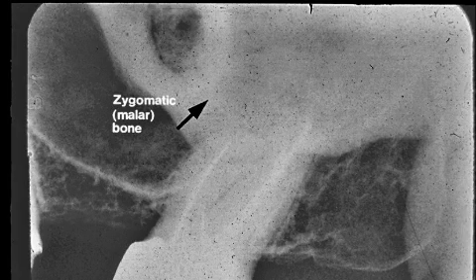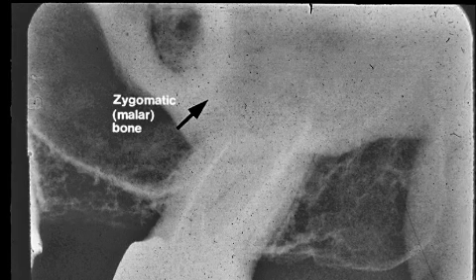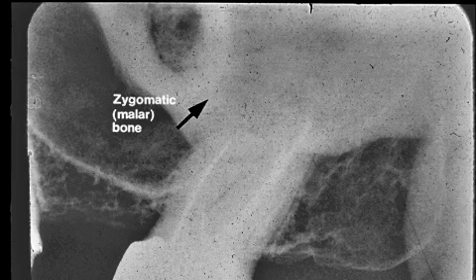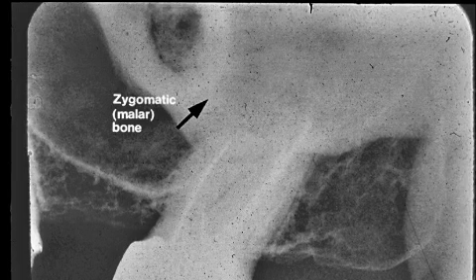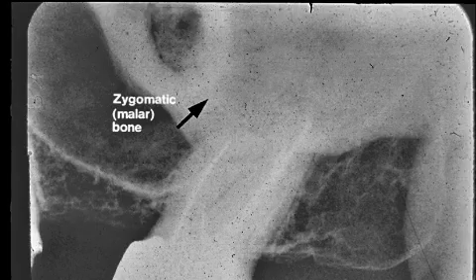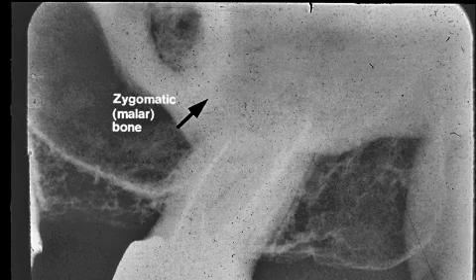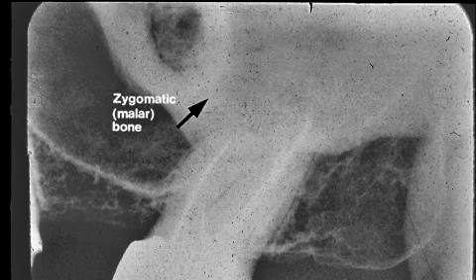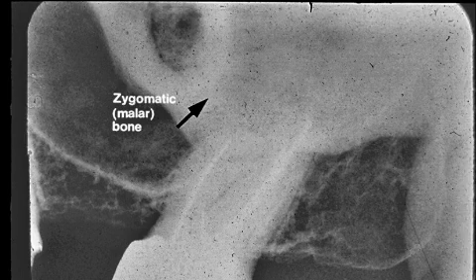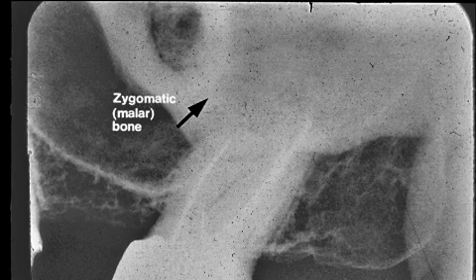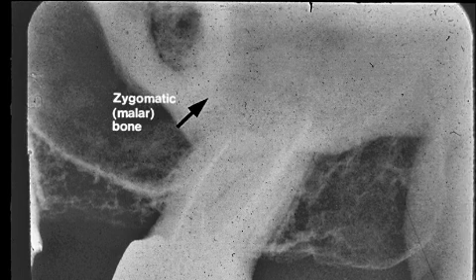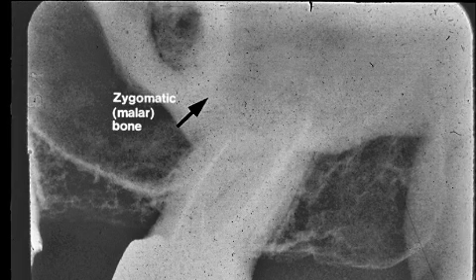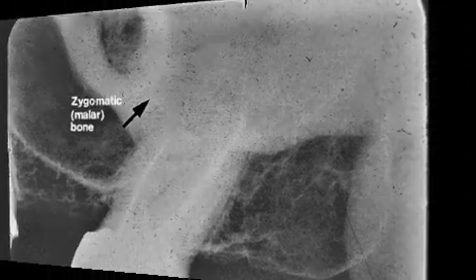The arrow points to the zygomatic or malar bone. It looks like a rectangle, and right above the arrow is a radiopaque U shape — this is the zygomatic process. The zygomatic bone extends posterior from the process.